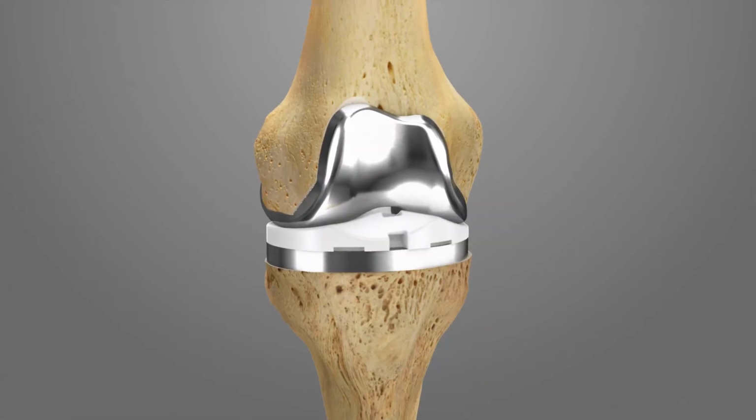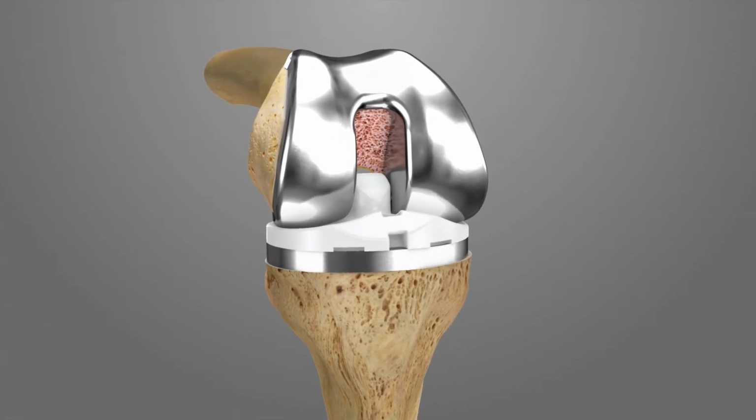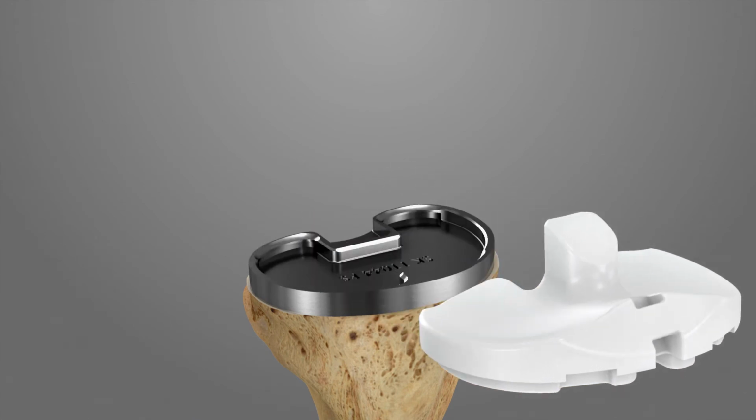Bring the joint through the range of motion to evaluate kinematics and ligament balance. Use different trial insert thicknesses to achieve desired balance and alignment. In the event soft tissue balance or joint alignment cannot be achieved, ligament balancing using standard soft tissue releases may be considered. Remove the trial insert.